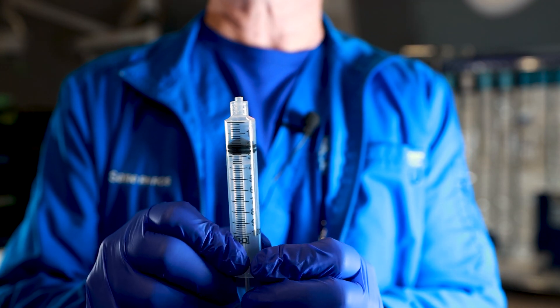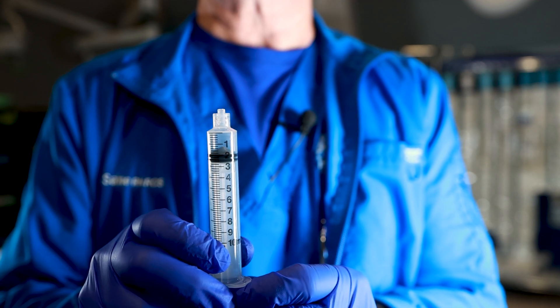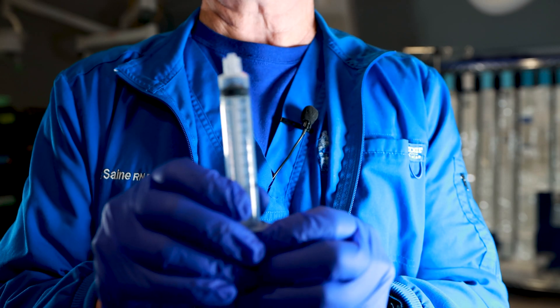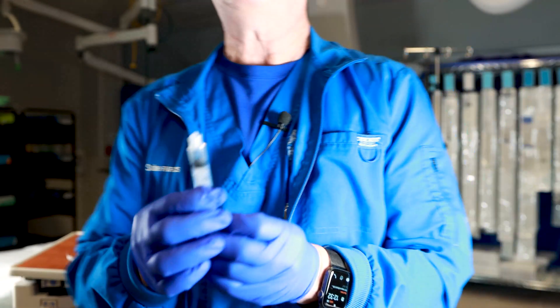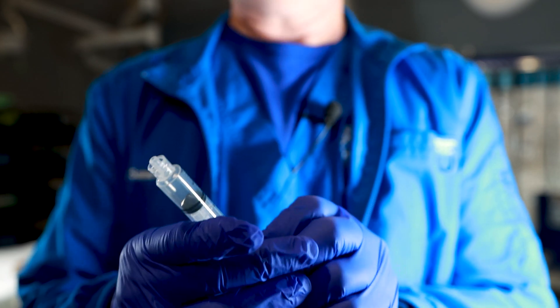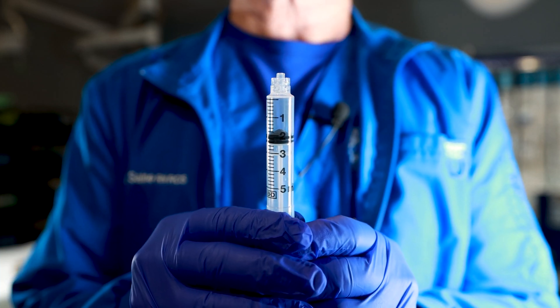If I was giving all two cc's that would be okay, but oftentimes when you draw a medication you're going to give part of the cc. If I gave one cc that would be relatively easy, but sometimes you're giving a half or a quarter of a cc — that's difficult to do with a 10 cc syringe. A 5 cc syringe makes life a little easier.